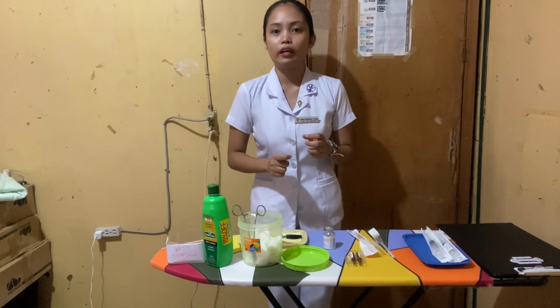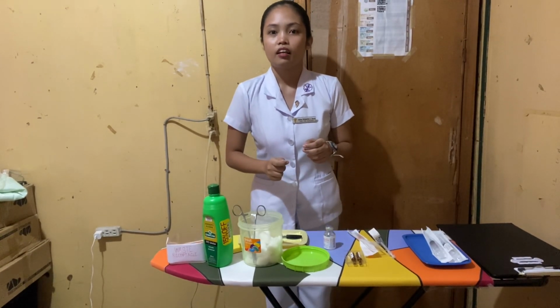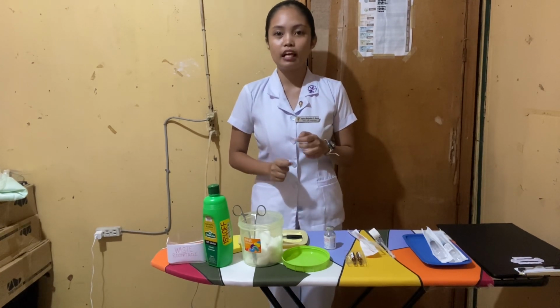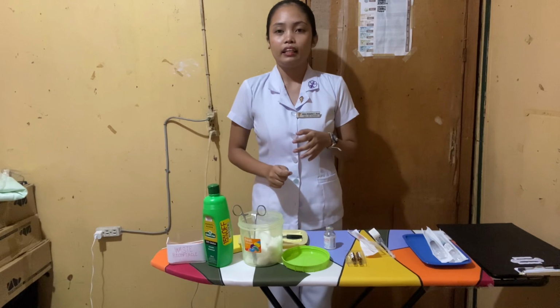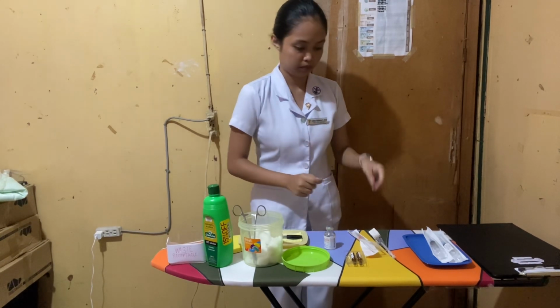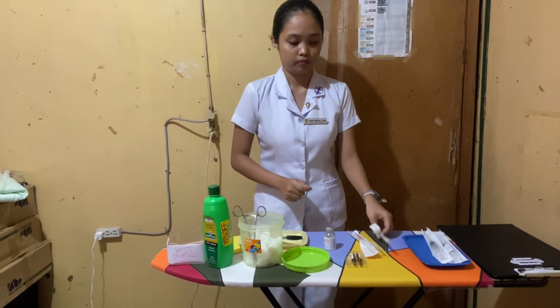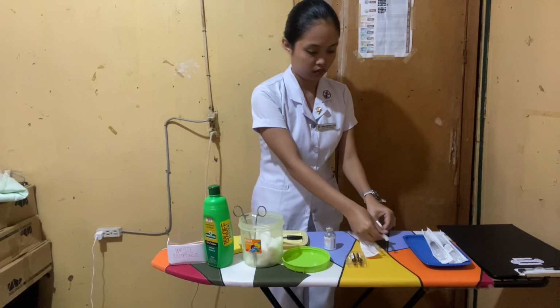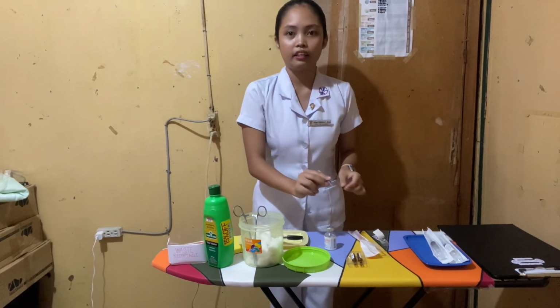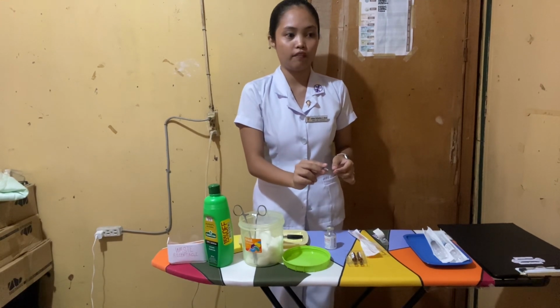After that, I'm going to get my syringe and uncap the syringe, and then I'm going to draw air into the syringe. The amount of air will be equal to the amount of the medication that needs to be administered. And then I'm going to push the air into the vial.